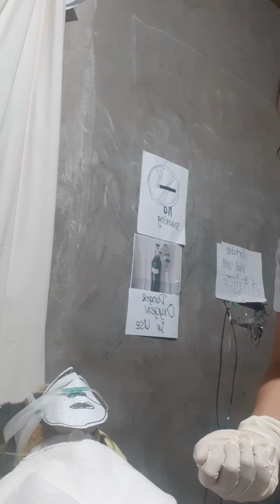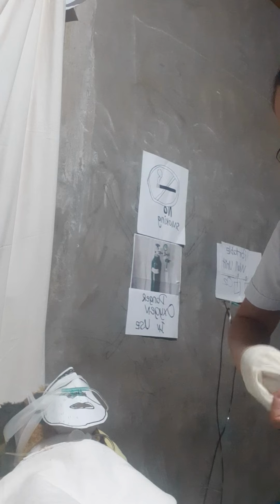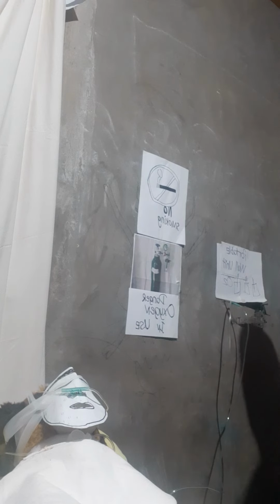And after removing the gloves, we need to put it in the proper receptacle.